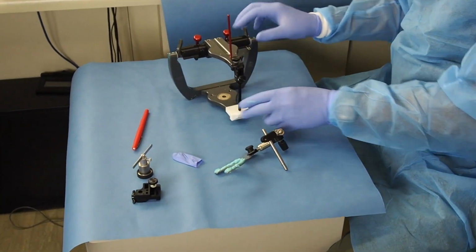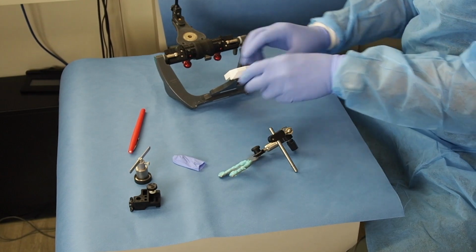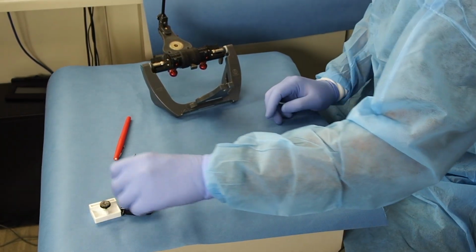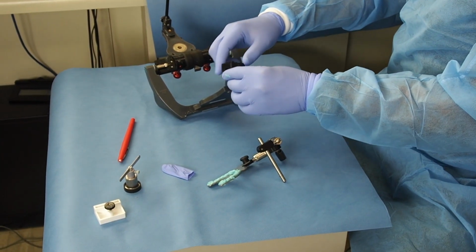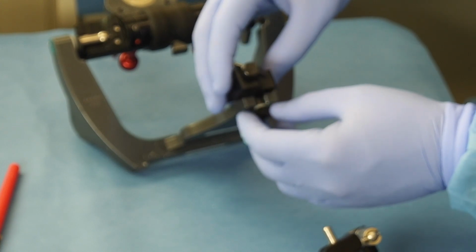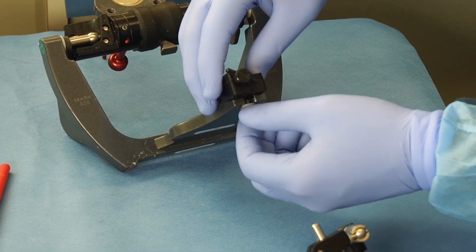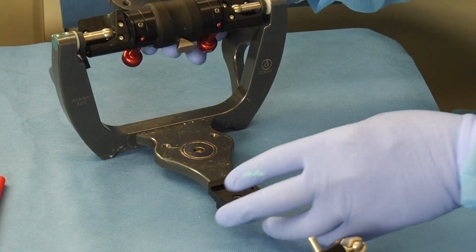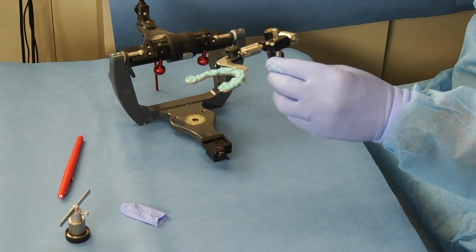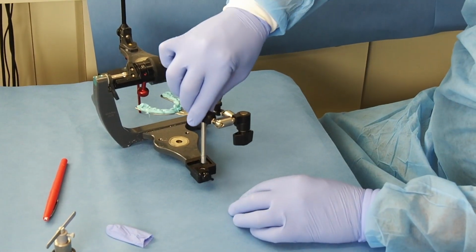The Denar Mark 320 articulator has magnetic plates, and it will have this incisal table. I will remove the incisal table and place the mounting table. The mounting table will hold the articulated arm in it, and I will be able to now mount the case on it. It goes like this. Now remember, the short part went onto the Facebow. Now the long part goes onto the articulator.